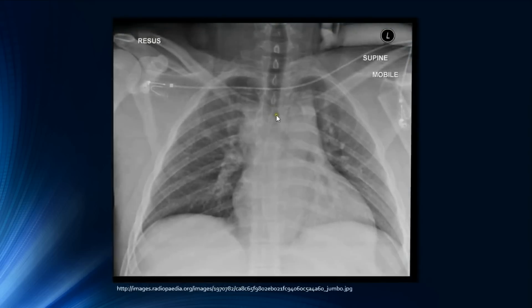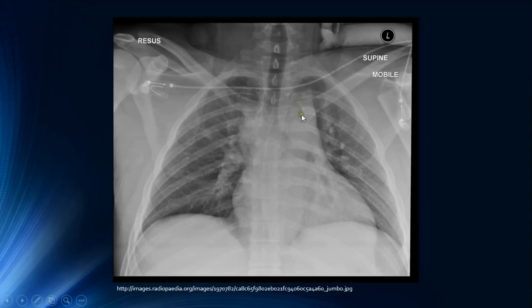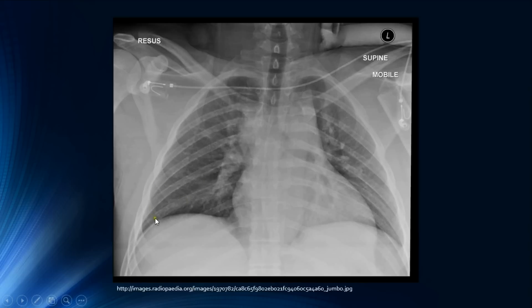Now let's look at the AP projection radiograph seen previously. This chest radiograph is also rotated — you can see the clavicular heads are not equidistant from the spinous processes. The spinous process is much closer to the right side than the left, meaning the patient is rotated, which can give false enlargement of the heart size and false consolidation. Additionally, this patient has not achieved adequate inspiration, as the sixth rib is not intersecting the mid-clavicular line at the diaphragm.